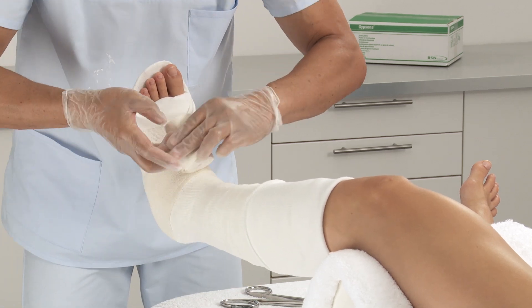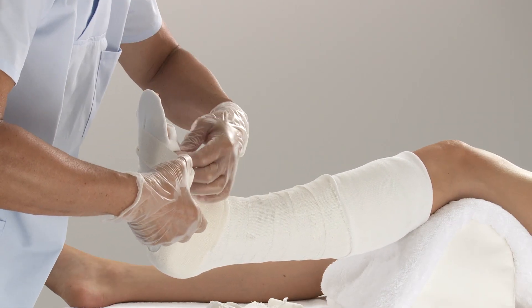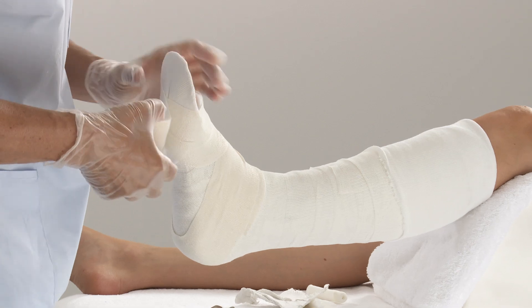Using a bandage, wrap around the ankle, first going distally and around the metatarsals, then proximally. Proceed up the lower leg, overlapping by 50% and fix.